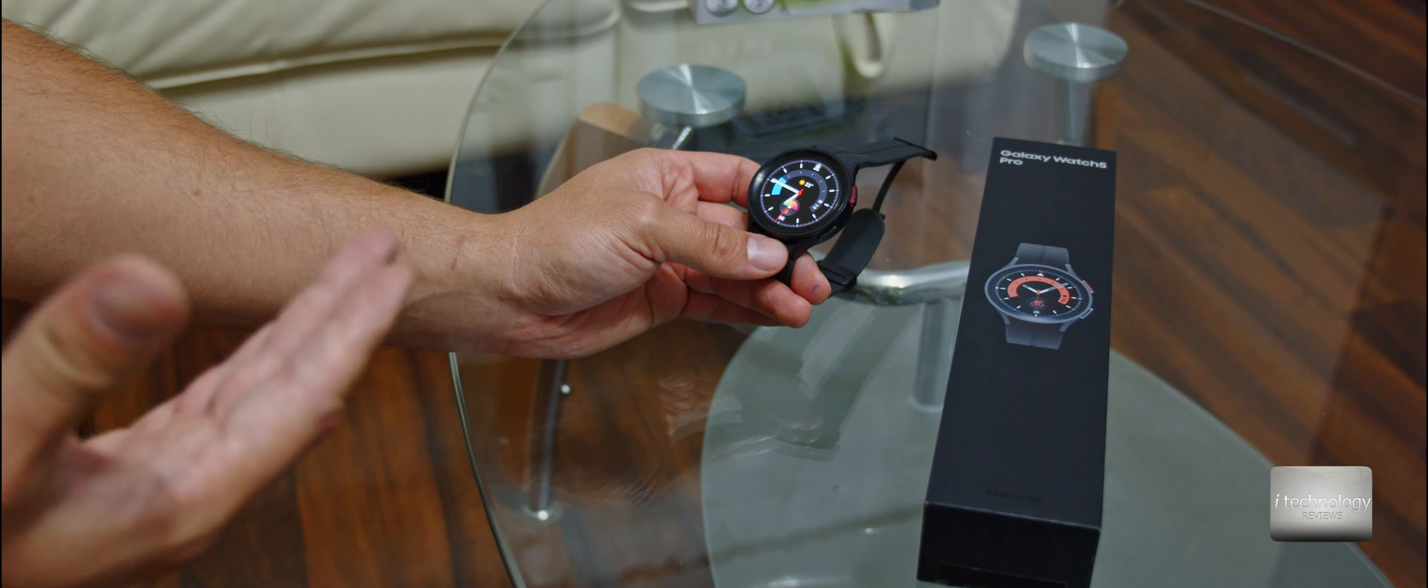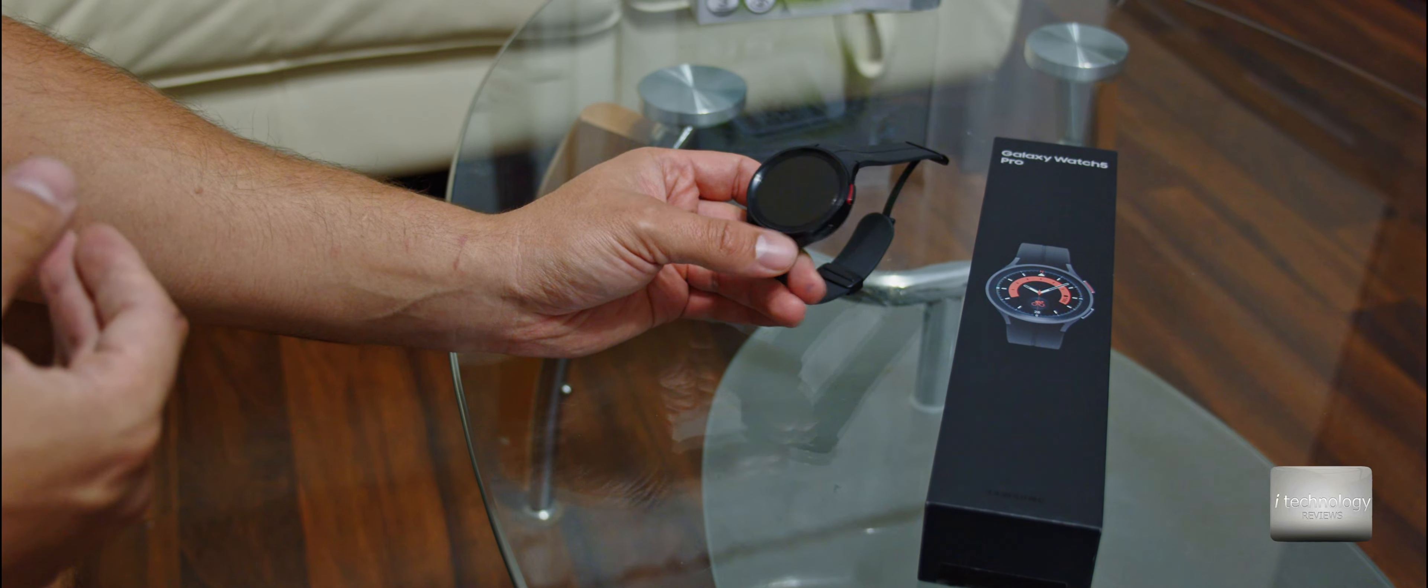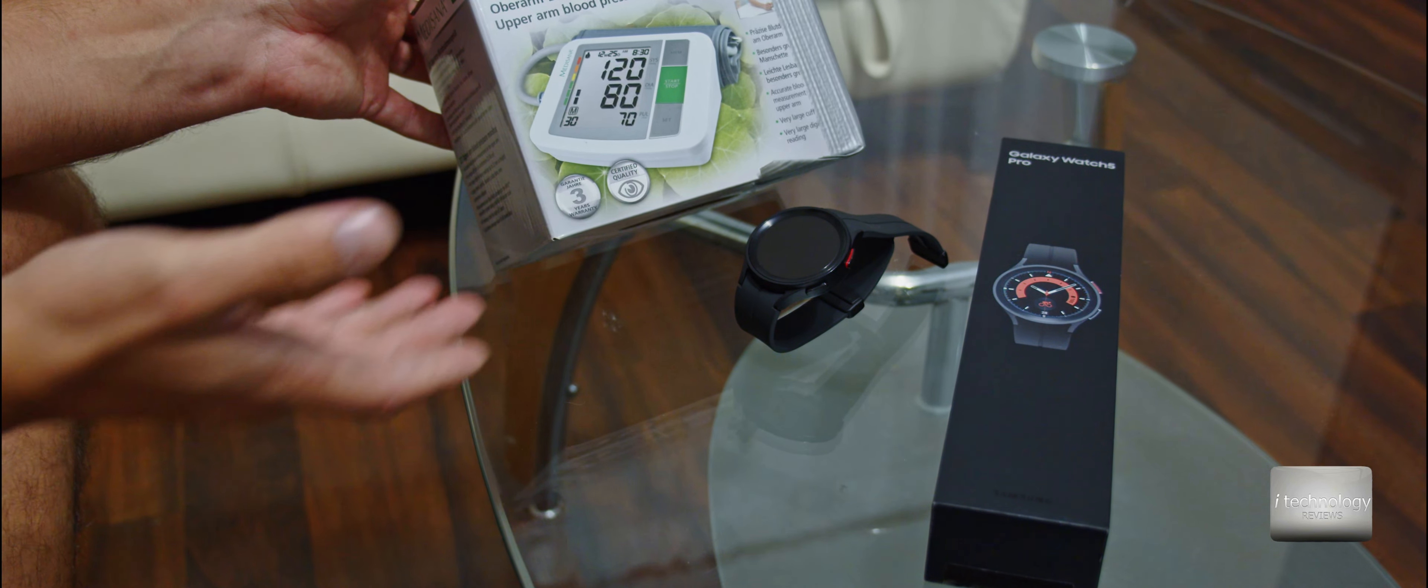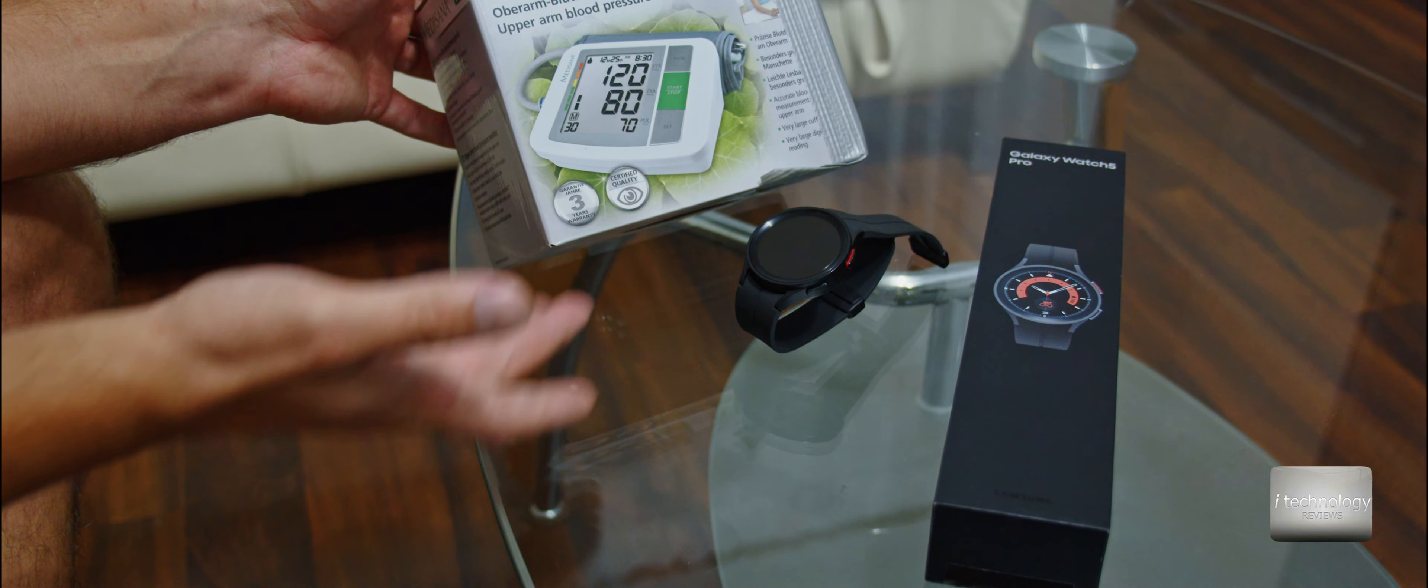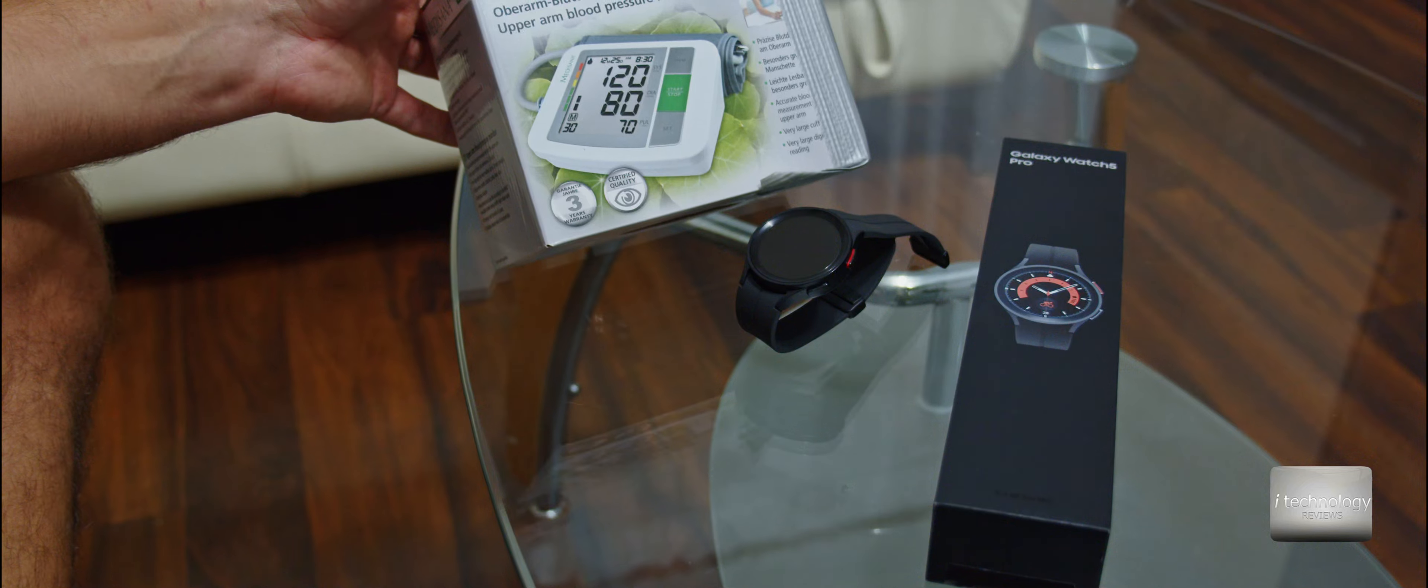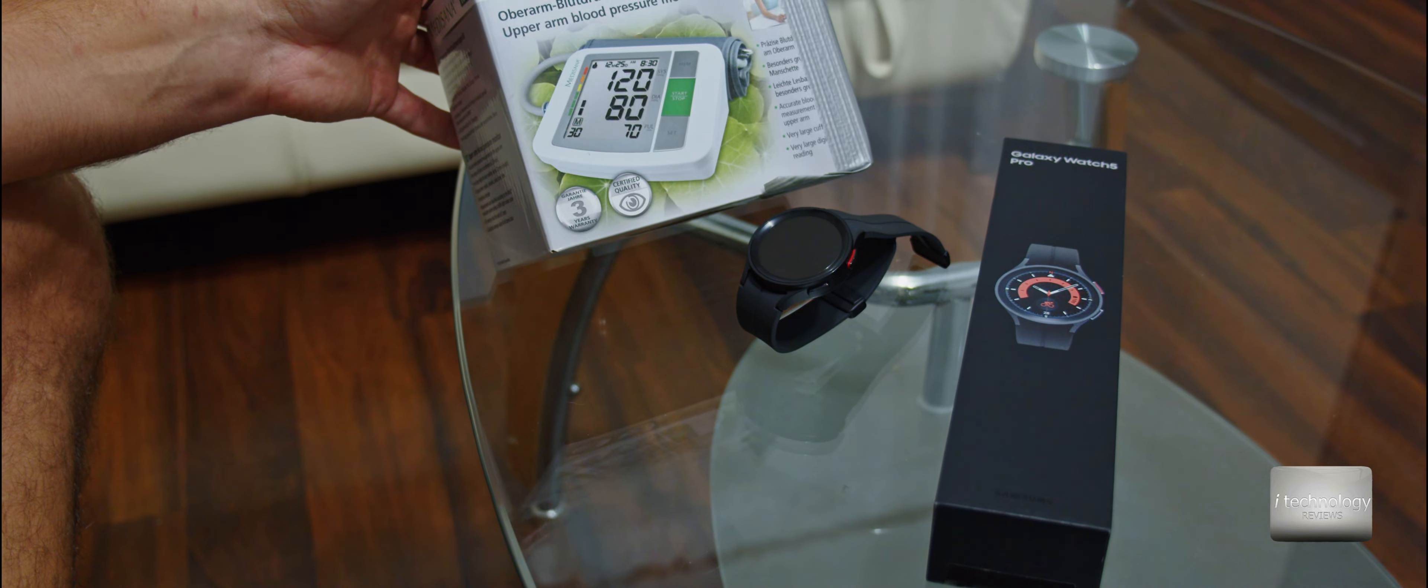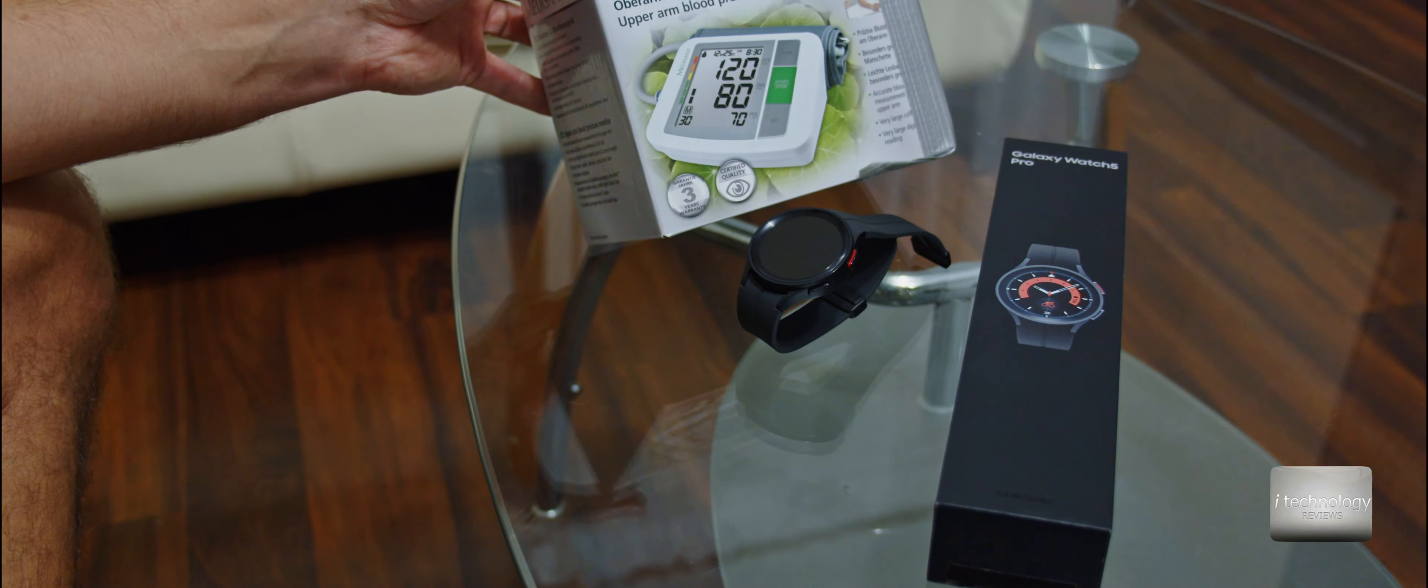I want to measure how accurate the blood pressure monitoring is, because there are a lot of devices on the market, medical devices, blood pressure monitoring devices that will measure your blood very accurately.